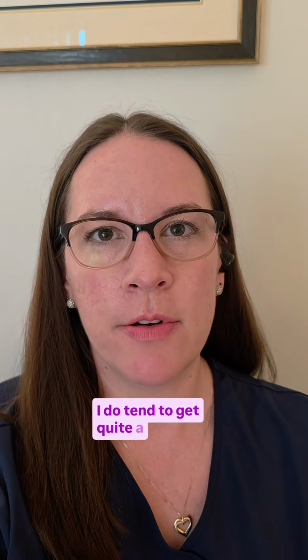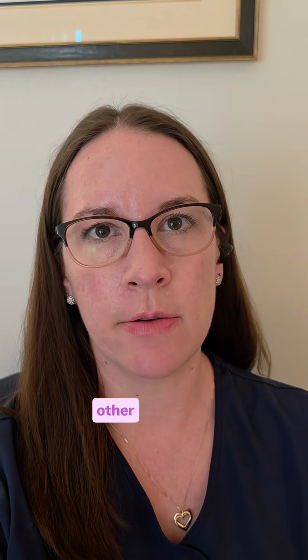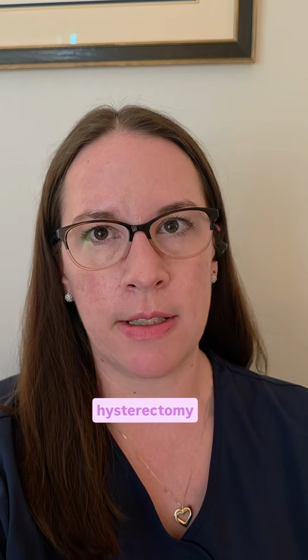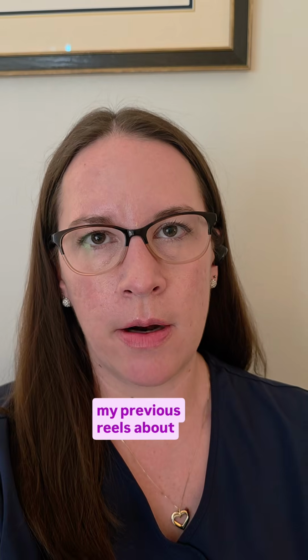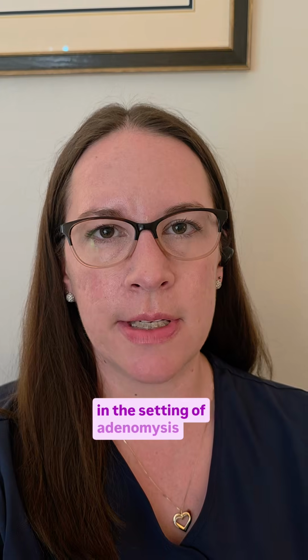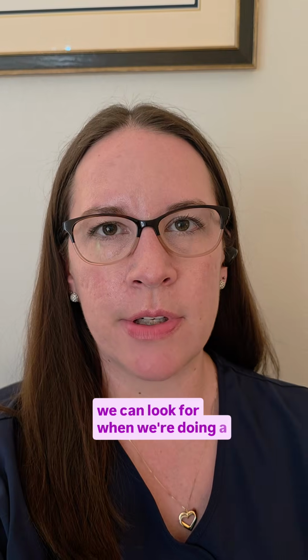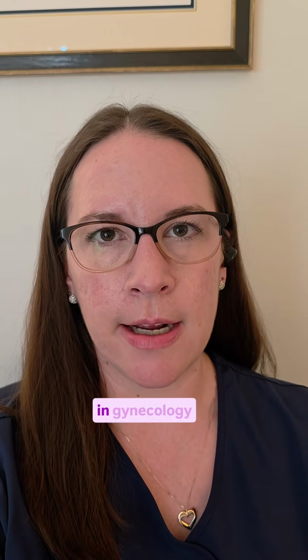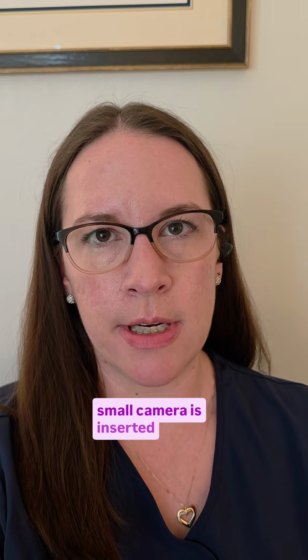So I do tend to get quite a few questions about whether or not adenomyosis can be diagnosed any other way aside from a hysterectomy. And I've spoken and made previous reels about the sonographic findings that we see in the setting of adenomyosis. But there are some things that we can look for when we're doing a procedure that's commonly done in gynecology called a hysteroscopy, which is where a small camera is inserted into the uterus.